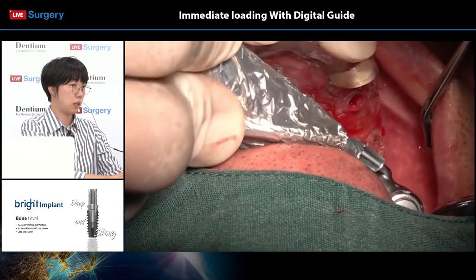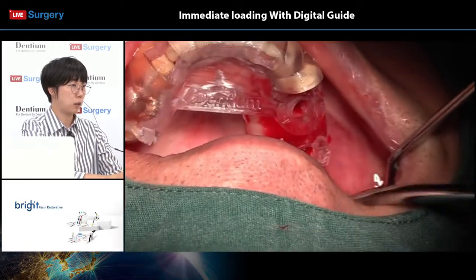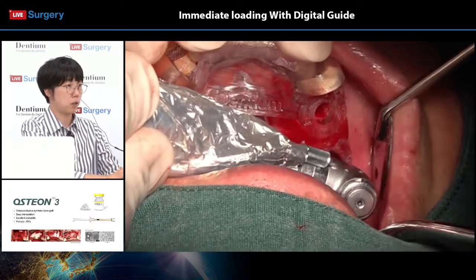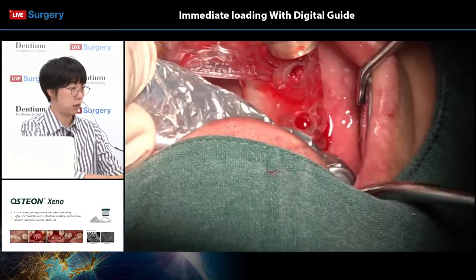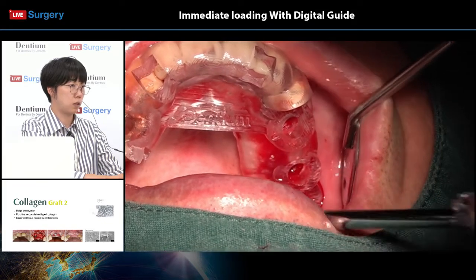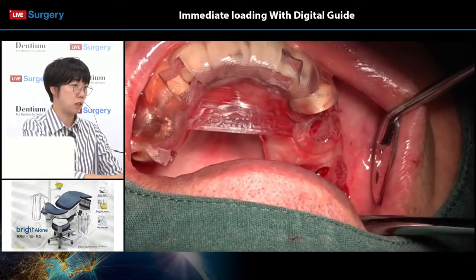As you're seeing now, an up and down motion is very important to allow copious amount of irrigation. Without it, you'll have overheating in that area, and that will be a great hindrance to the osseointegration of the patient's bone and the implant surface. We don't want bone necrosis to occur during the drilling procedure, so please make sure that your surgical site is irrigated enough.